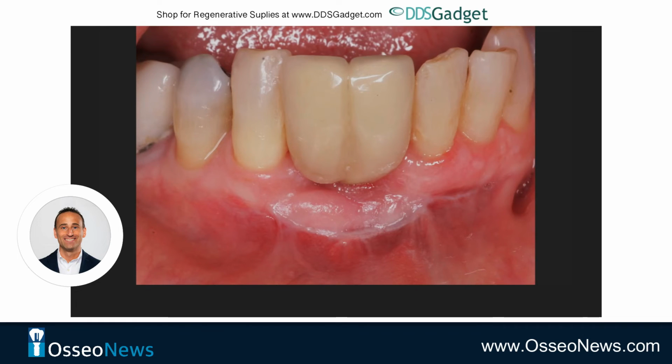Here we are about 6 weeks later, and we could see that we've had successful take of the graft. Despite that, you can appreciate how much the graft did shrink relative to the initial placement. Nevertheless, this procedure was successful. The patient's symptoms did go away, so that was the best part. Unfortunately, I wasn't able to continue to see this patient after this, but I'm confident that this graft just continued to mature over time and look better and better, because these grafts tend to do that.